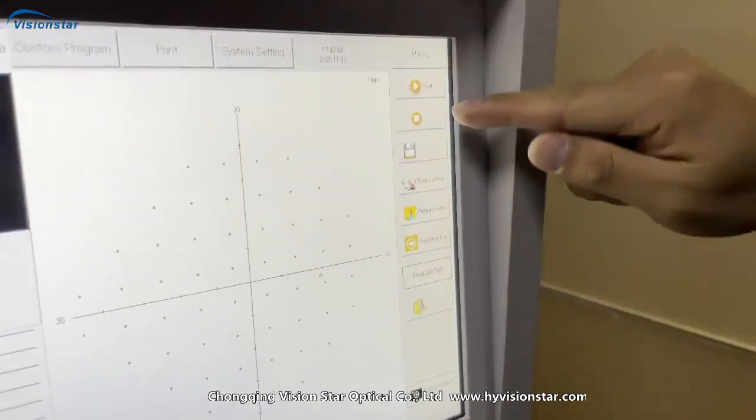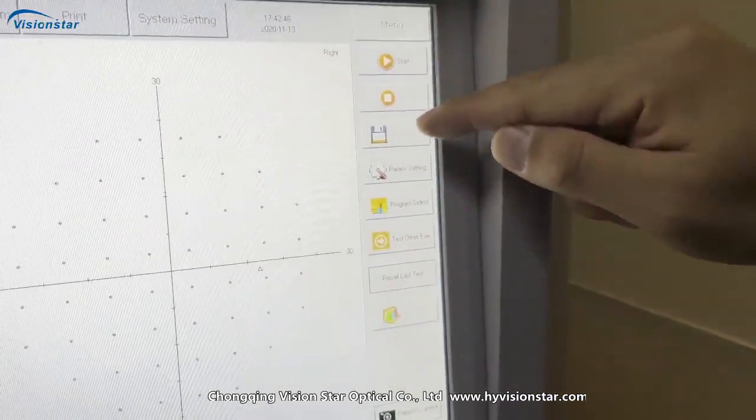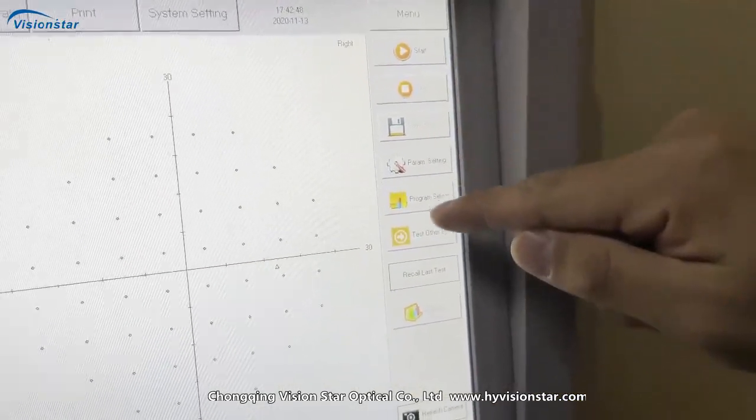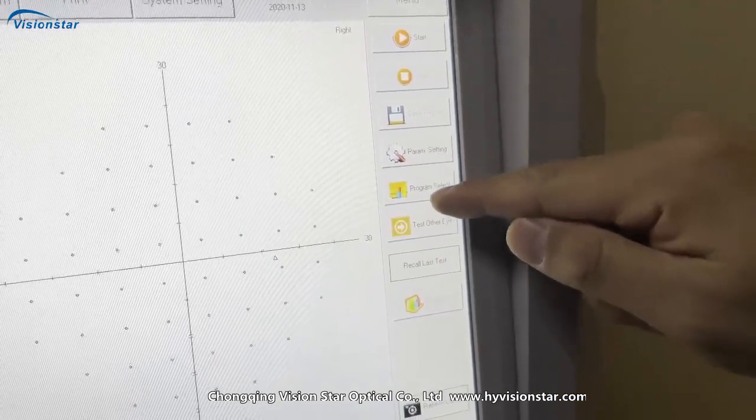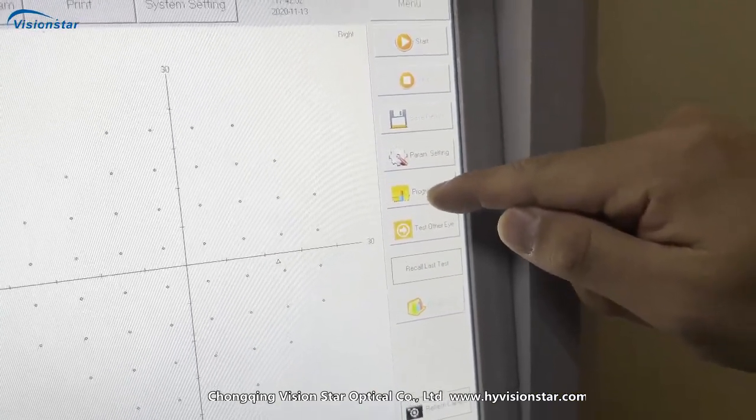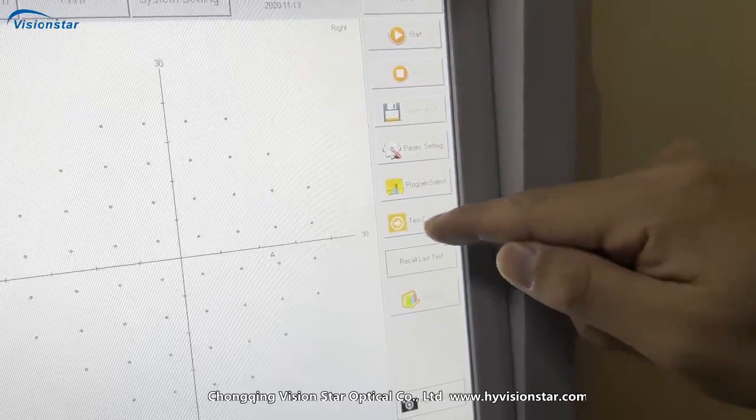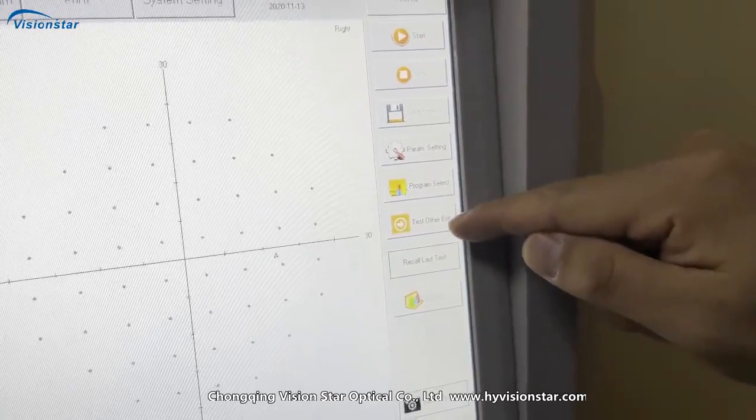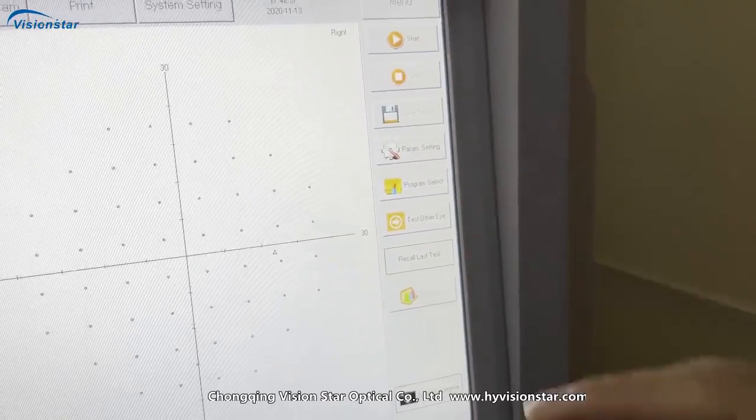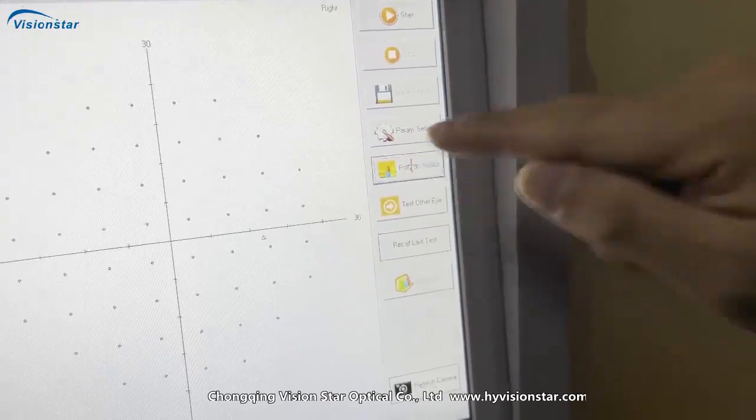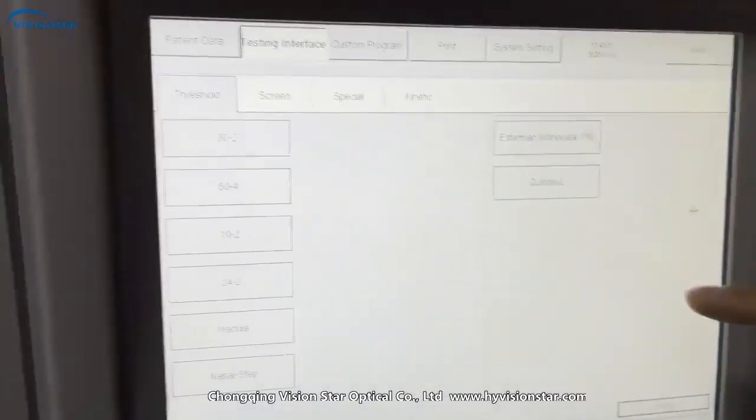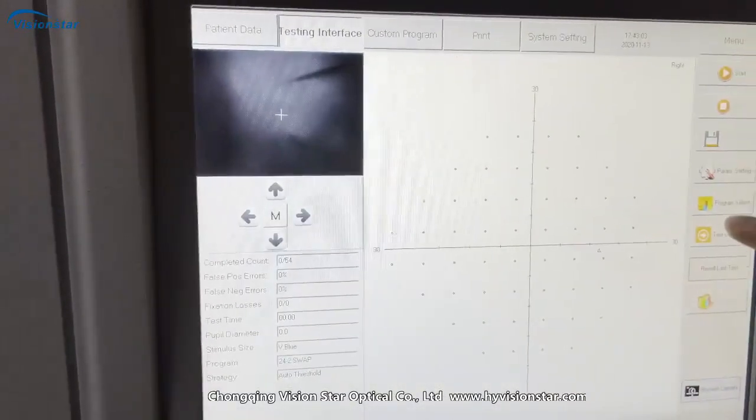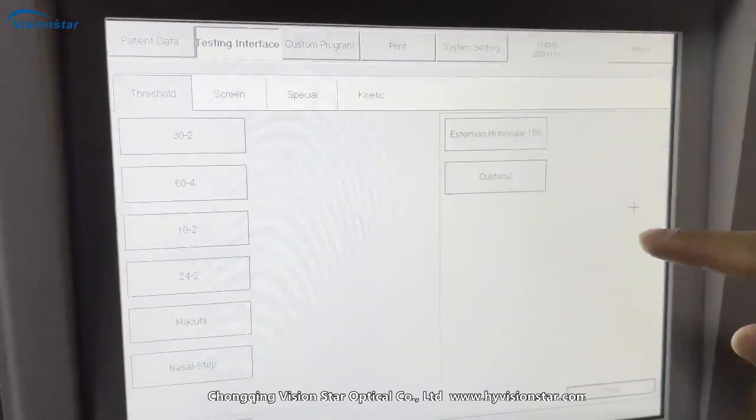And this part is start testing, stop, save report, program setting, program select, and test other eye. So now, let me show you this program selected.